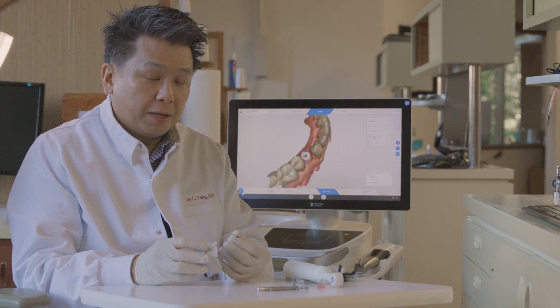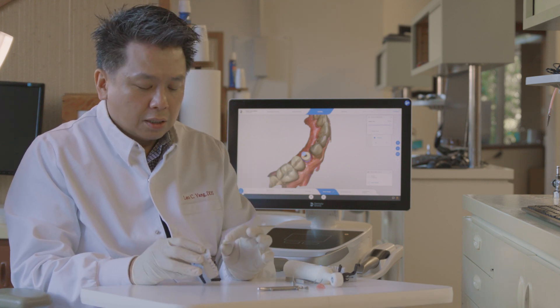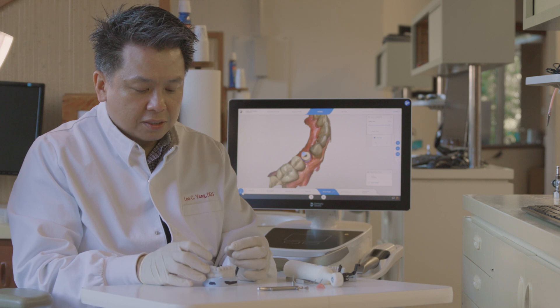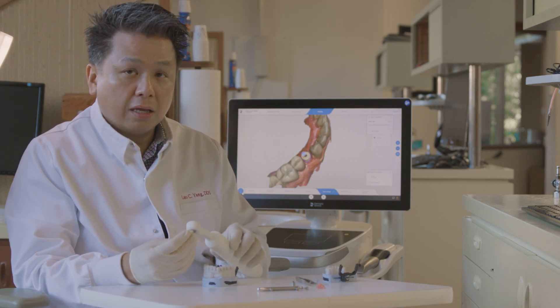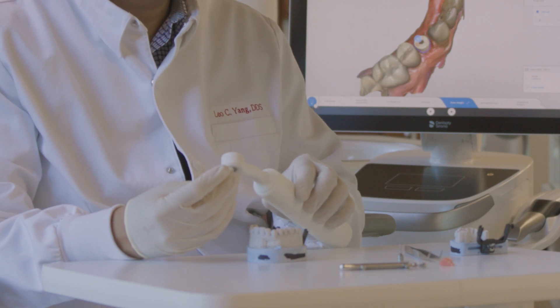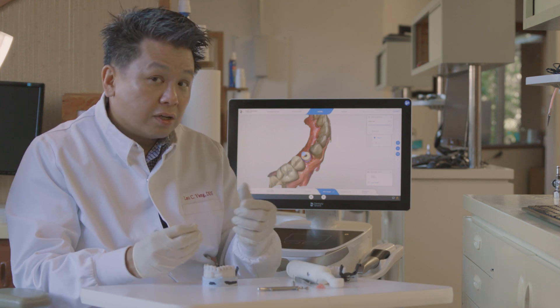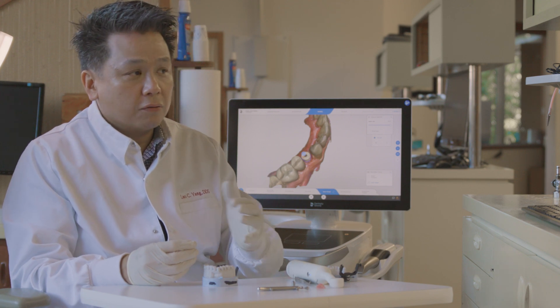One thing to pay attention to is that this is a pretty tall crown, so you have to visualize where the coping is going to be and why that's important. Sometimes if you aim too high, you're not really aiming at the coping. You have to aim a little bit lower where the coping is — that's where it's going to deactivate the smile lock. If it doesn't fully come out, don't freak out. Just do the buccal again, then lingual again for four seconds.